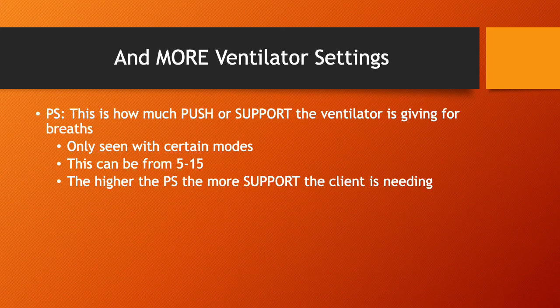So the last ventilator setting that I know I didn't mention on that first page, but that you're going to see on certain modes, specifically we're going to talk about PSV, or pressure support ventilation, as a mode. There is another setting that is called PS, which stands for pressure support. And this is how much push or support the ventilator is giving for breaths. So that means, even though I'm taking my own breaths, the ventilator is pushing in that air to take off some of that workload for me. So we only see this with certain modes.